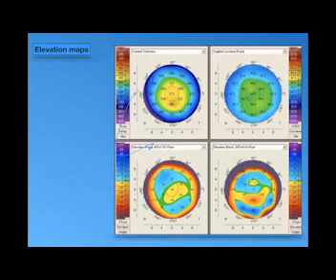As we are saying all the time, there is no such thing as a must or 100% assurance in science, but at least keep your patient away from the suspicious points. If the K reading is regular, the bow tie is regular, and the K reading is within the normal range, which is up to 49 in some authors and publications.